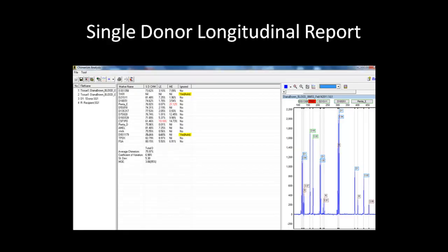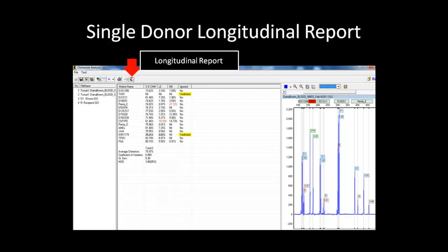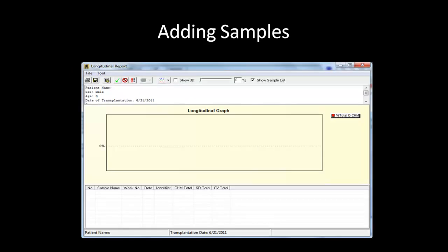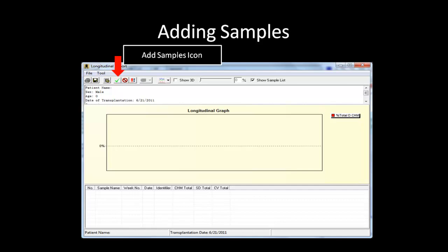The longitudinal report can only be accessed from the chimerism results page. Click on the icon shown here to gain access to the longitudinal report window. If this is the first time you are analyzing samples for a specific patient, the longitudinal report will appear blank. To add samples to the longitudinal report, click on the add sample icon shown here.